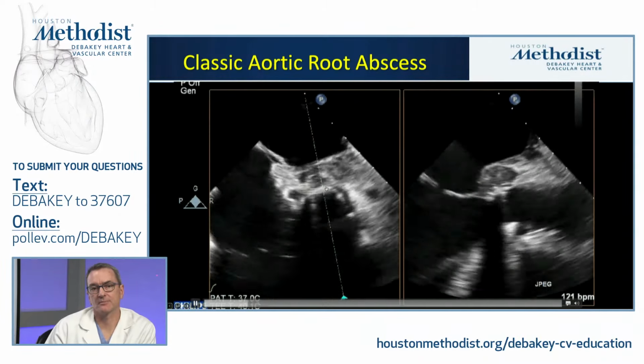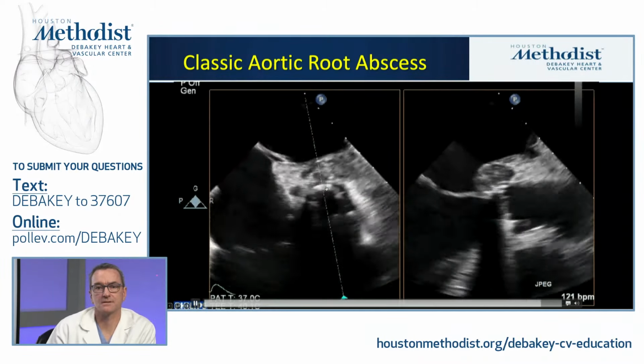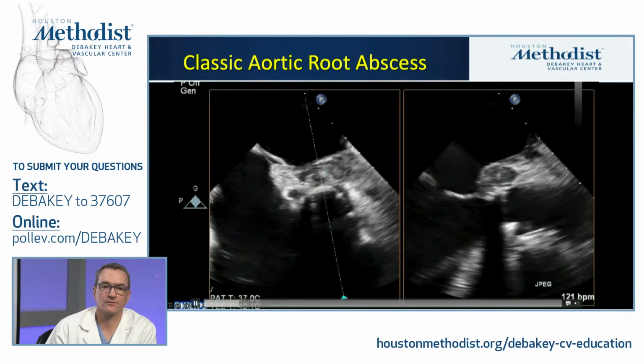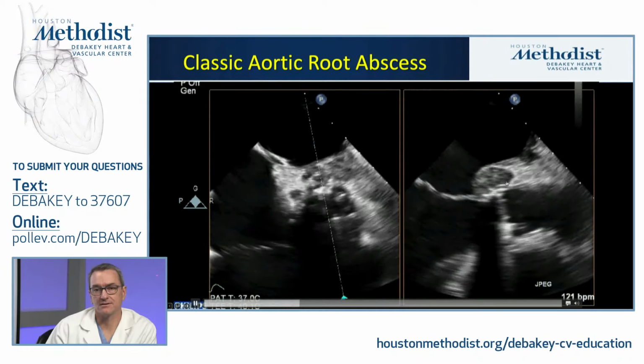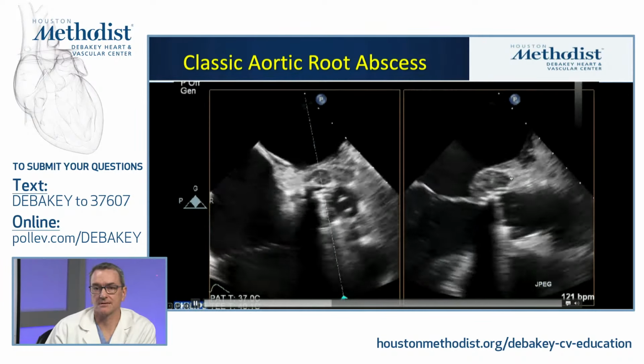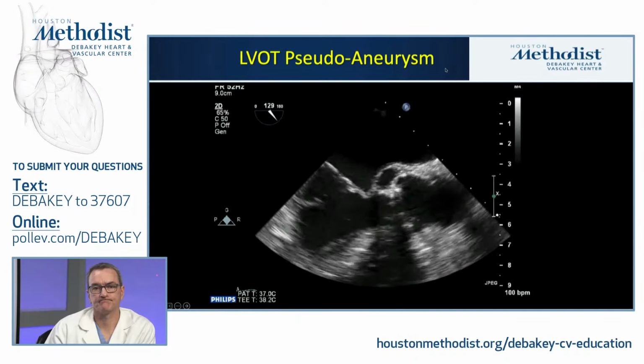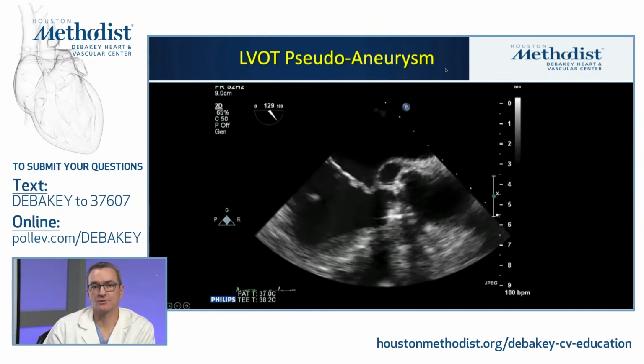This is the more typical appearance of an aortic root abscess in the setting of prosthetic material, and you can see it's very non-homogeneous all the way through, so these little pockets of bacteria, but it's contained. It's not pulsatile, there's no flow in it. This will not be cleared by IV antibiotics.